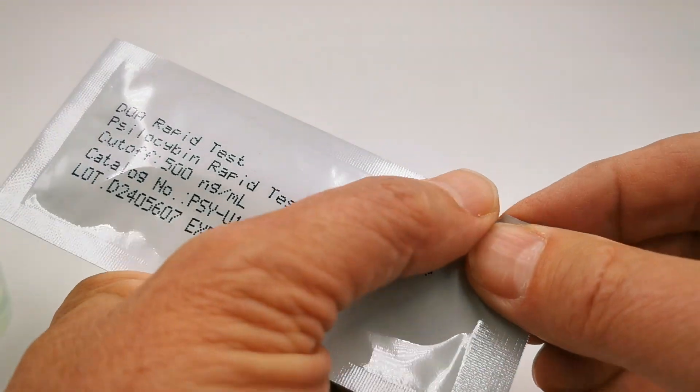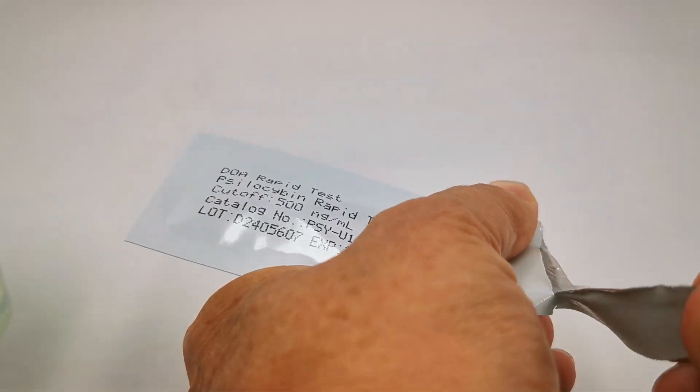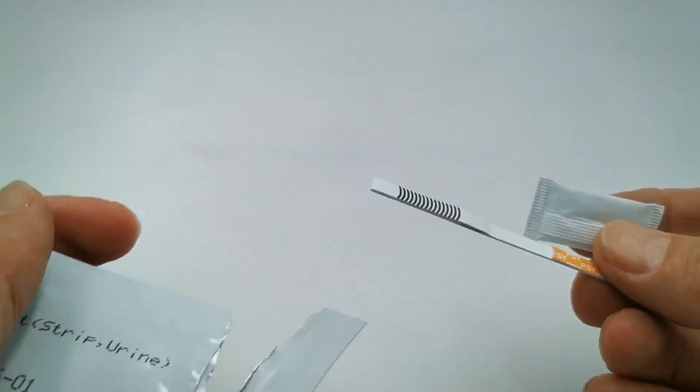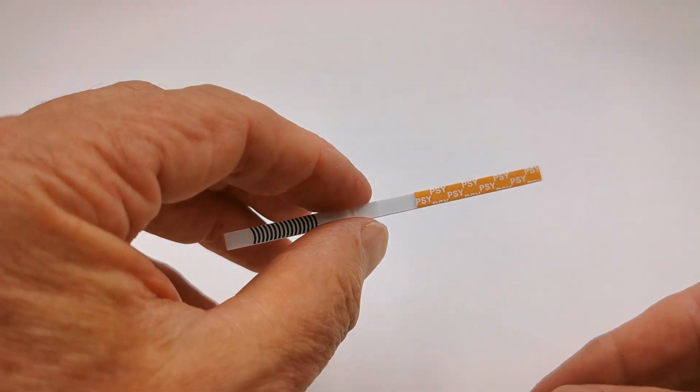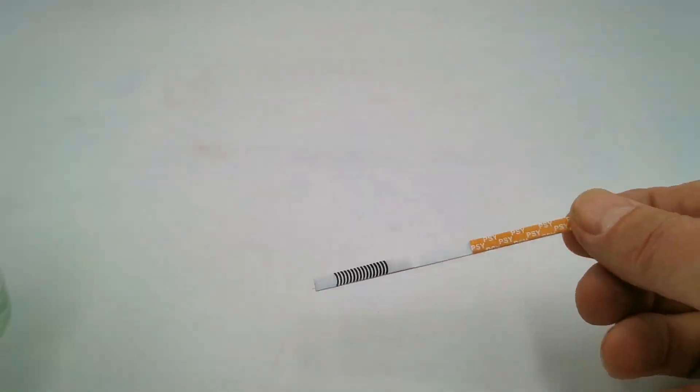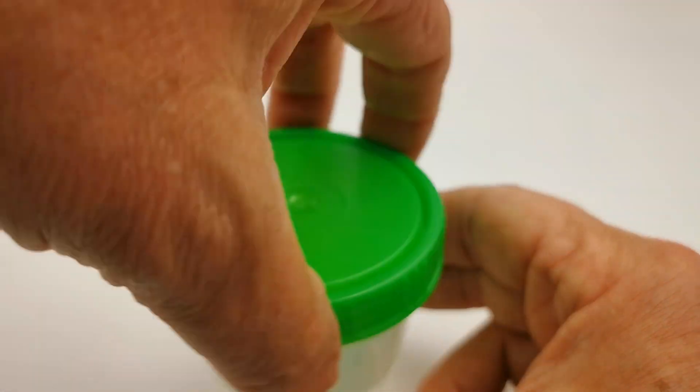When you're ready to do the test, open the foil and inside we should have a psilocybin test strip with PSY on the handle and the foil pouch of desiccant which is to keep the test strip dry.